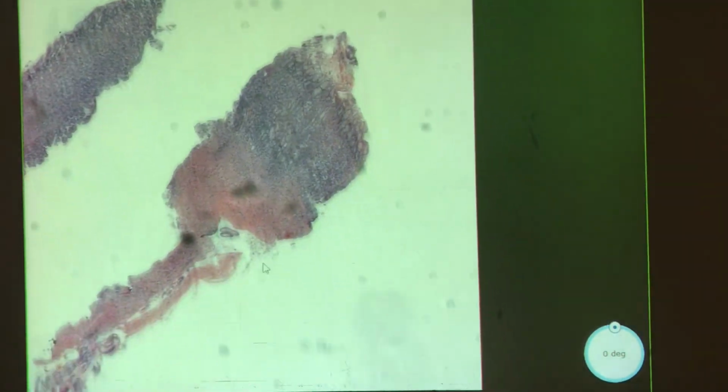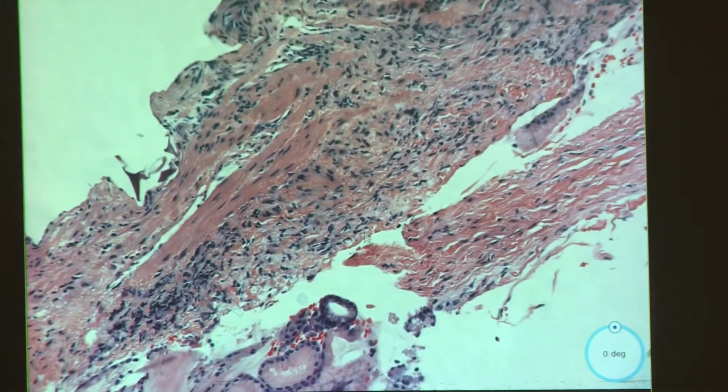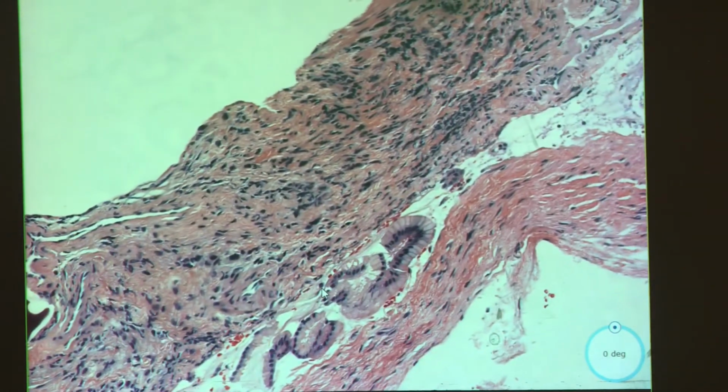I'll let you hunt for a bit, and then I did annotate this to help. Okay. So it's a small focus? Yes and no. Or is it like obvious? It's kind of obvious once it's pointed out. Okay.